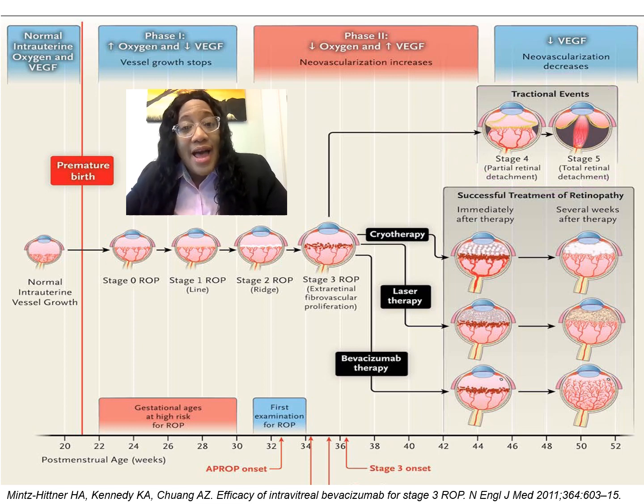Treatment goals here have been to reduce the angiogenic stimuli from the avascular periphery in order to decrease VEGF levels. Treatment has advanced from cryotherapy in the 1980s with its poor structural outcomes to laser therapy in the 1990s with peripheral deficits, and laser therapy remains the current standard of care.